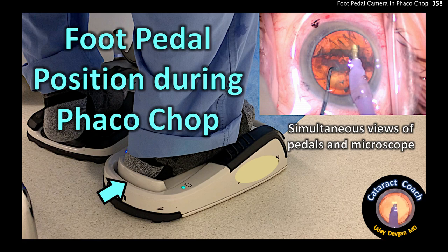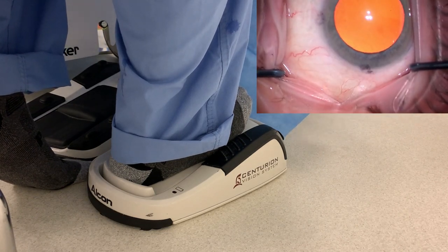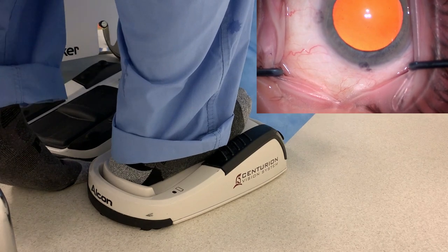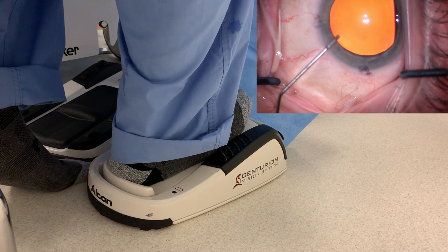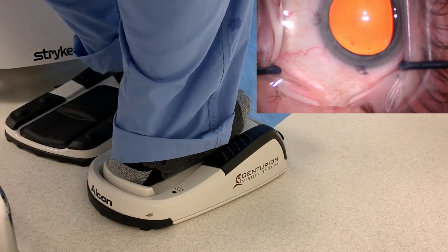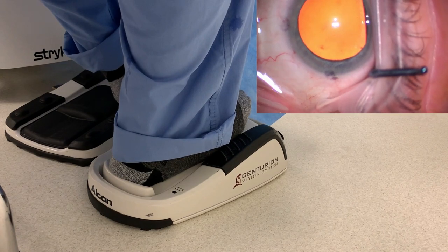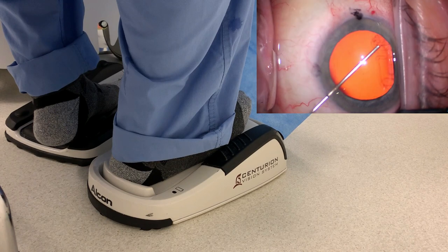cataractcoach.com — foot pedal position during phaco chop. I'll show you a simultaneous view of both the microscope view and the foot pedals. The main video screen is focused on my two foot pedals. The right foot is the phaco foot pedal, the left foot is for the microscope. In the top right corner of the screen is the view through my microscope, and we've synchronized these for simultaneous viewing.